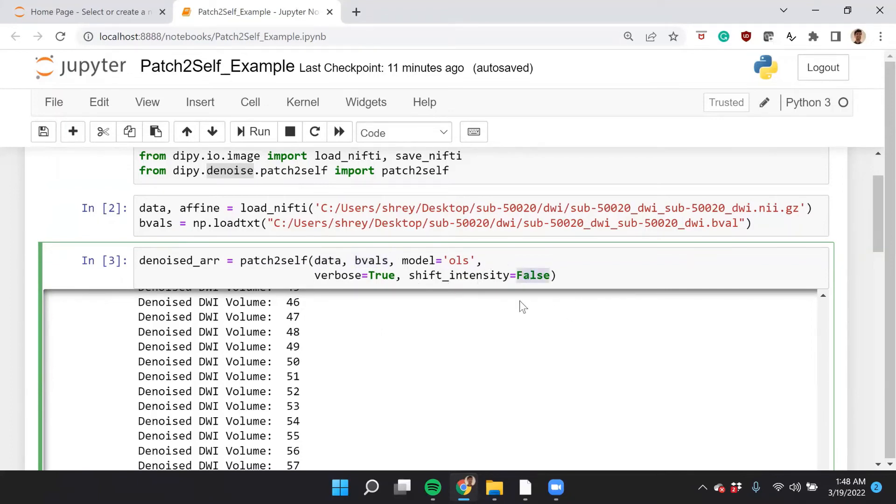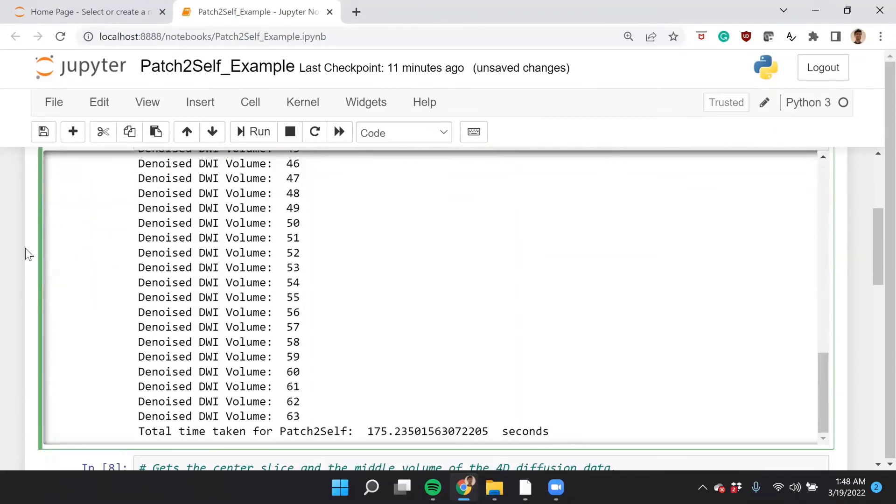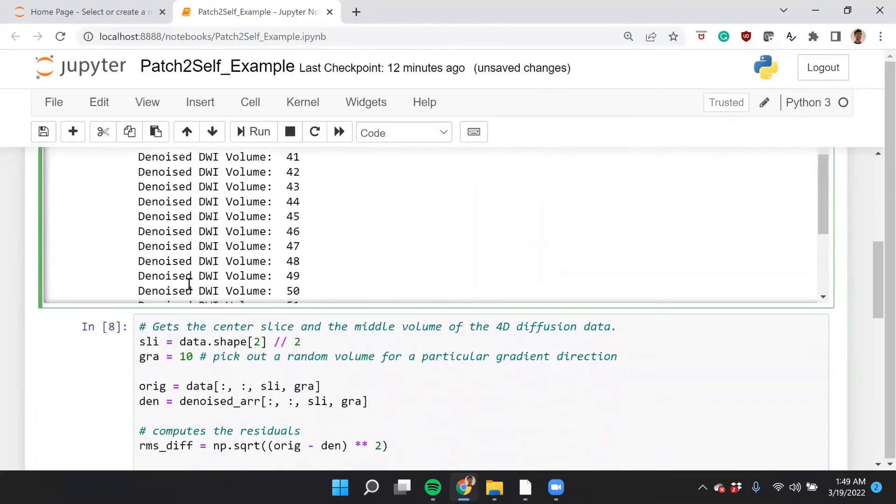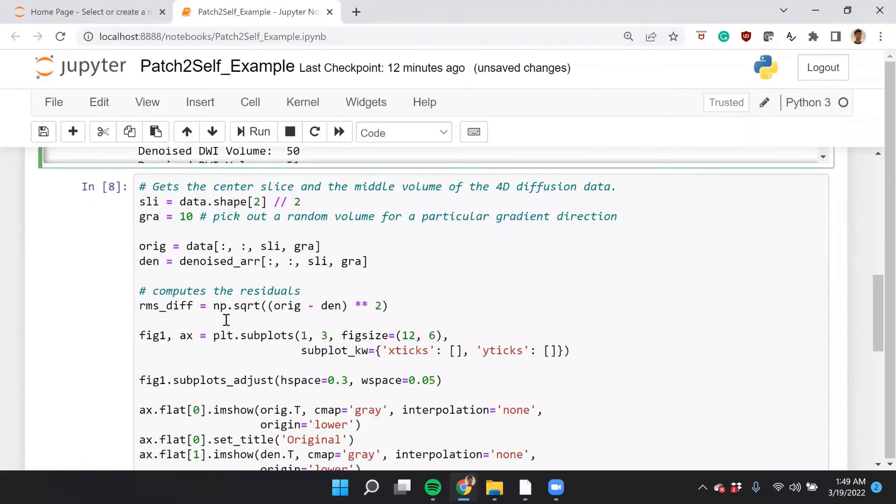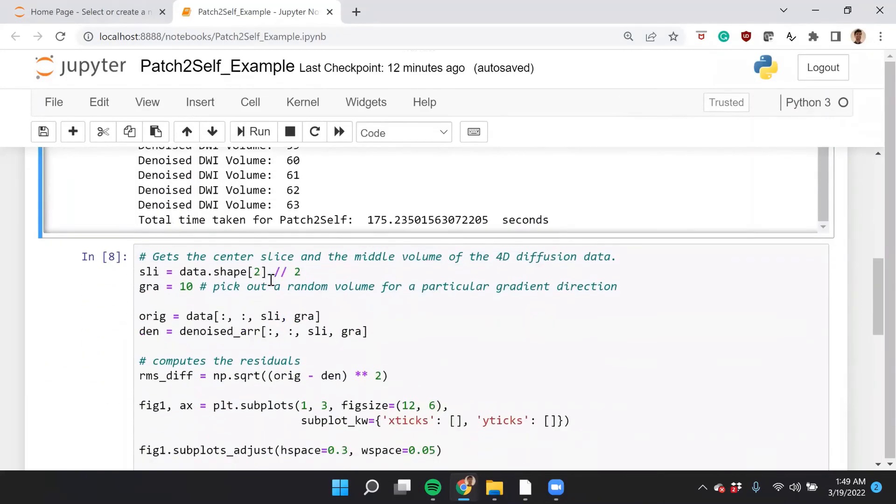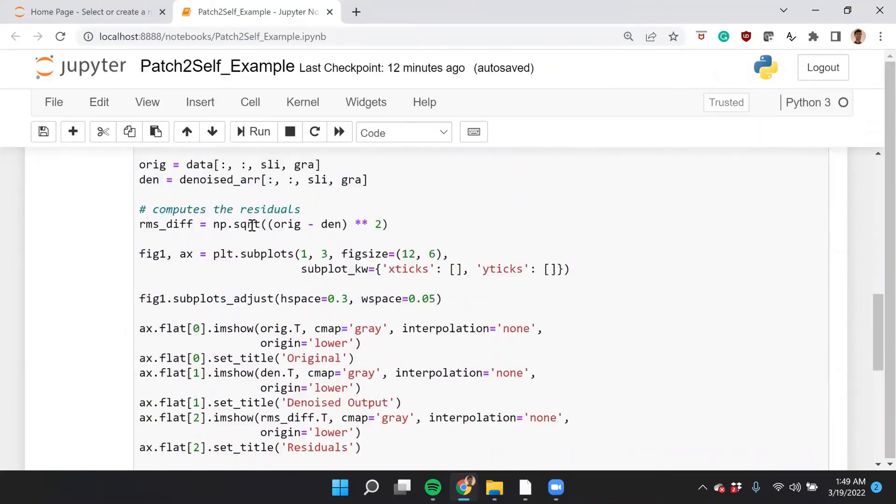Patch2Self, by default, requires only the data and the b-values as necessary inputs. All others are optional inputs. Whenever you're dealing with your own data, you want to set the shift intensity to true. This is just a necessary precaution. If you set the verbose flag to true, it will print an output, something like this, which essentially shows a progress of how the volumes are being denoised. If you have only one b-zero, then you skip denoising the b-zeros. But if you have more than one, then Patch2Self will denoise b-zeros also. Next, it also at the end shows the time, if you're interested.